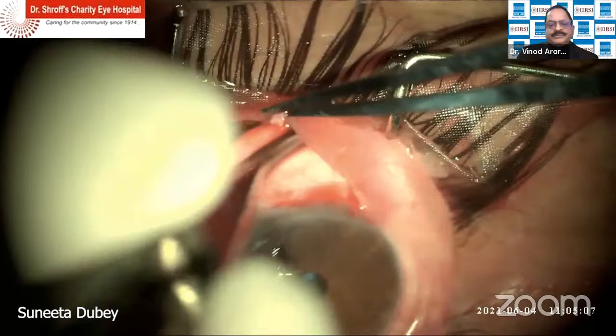And I think that is why we are not very comfortable using it. But it acts as a spacer also, and I think it prevents the scarring at the episcleral level because it acts as a reservoir and keeps absorbing the aqueous. So it maintains that space.